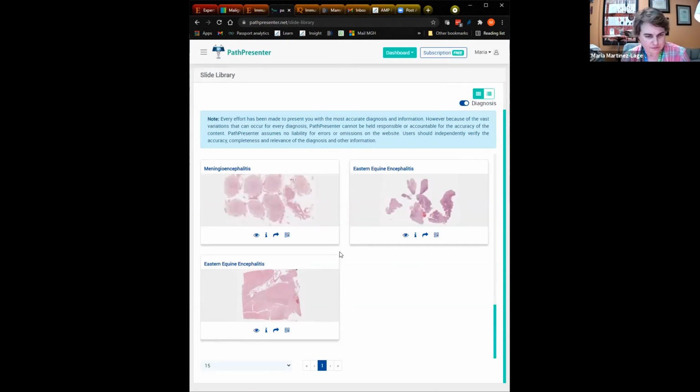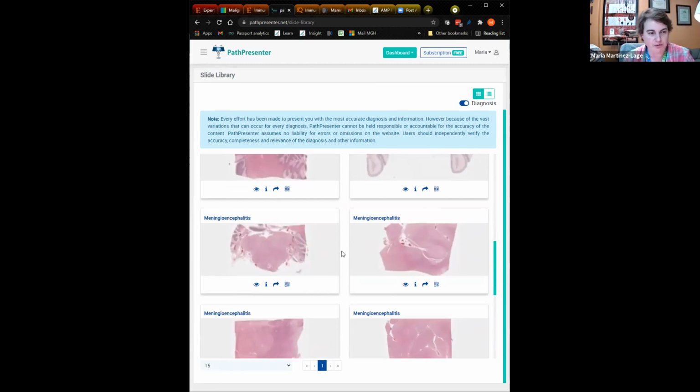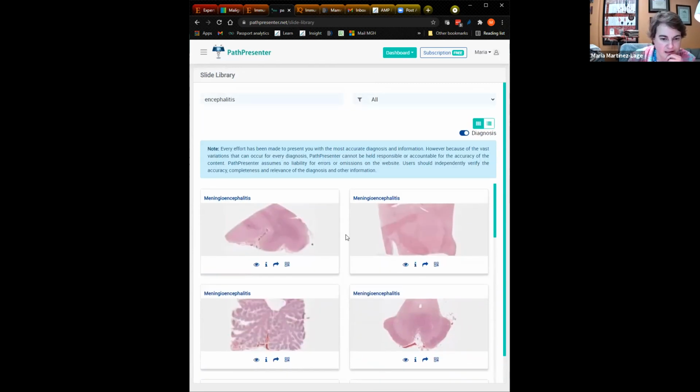Fungal infections, you can have aspergillomas, you can have long-term reactions that cause a granulomatous response to an aspergillus infection, and that can mimic a neoplasm as well. What you will see are granulomas with multinucleated giant cells, and you can detect the aspergillus by doing the usual special stains. Mucor, of course, can affect the brain by direct involvement from the sinonasal cavity, typically occurring in patients with diabetes. And that will also present as a destructive process that affects the vessels predominantly, and then the secondary ischemia of the underlying brain.